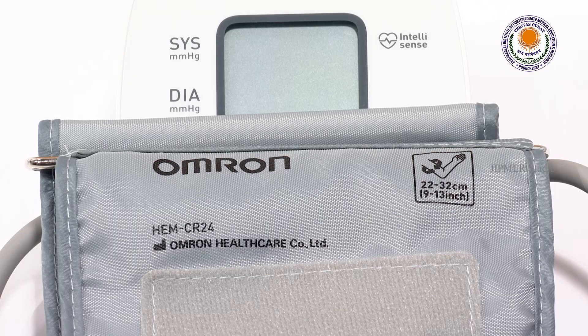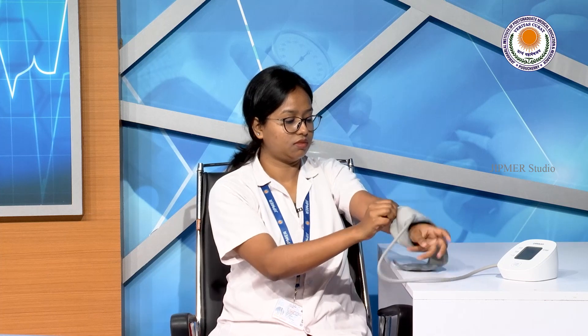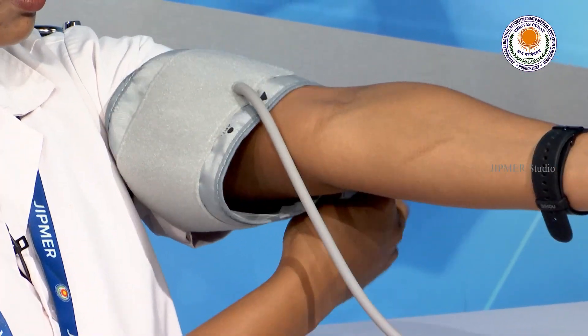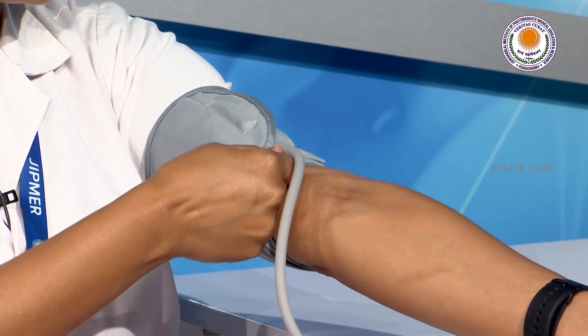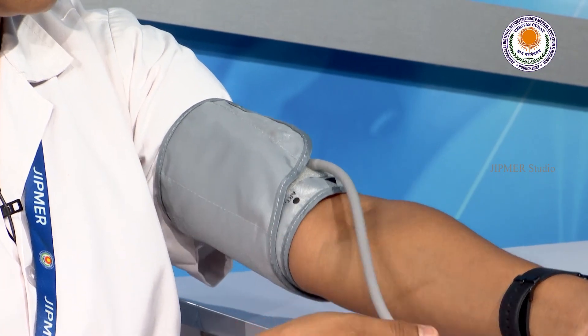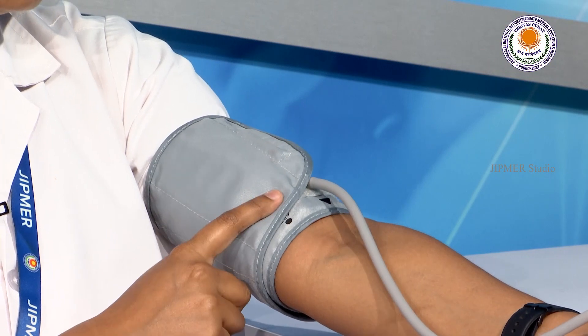Make sure that you are using an appropriate cuff size based on your mid-arm circumference. To check your blood pressure, place the cuff 2 to 3 centimeters above your elbow level. Keep your hand relaxed while checking your blood pressure. You can use two fingers to measure the distance above the elbow joint. The sensor of the cuff should be over the line of the artery, and the cuff should not be too tight or too loose.